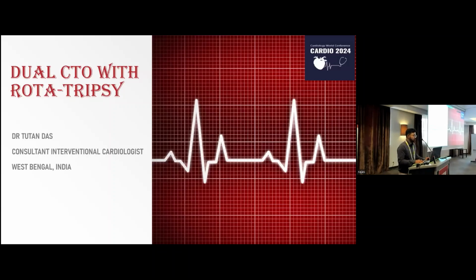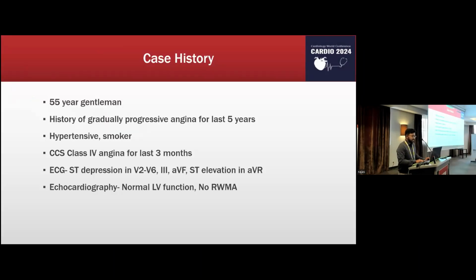Case is dual CTO with rotatripsy. Rotatripsy is rotablation, imaging, IVUS HD, and for calcium modification, I have used intravascular lithotripsy. This is my case history.